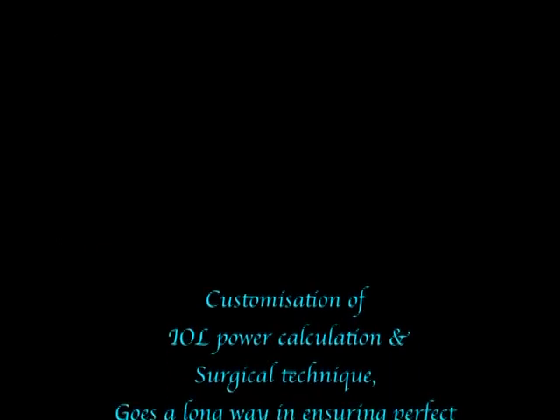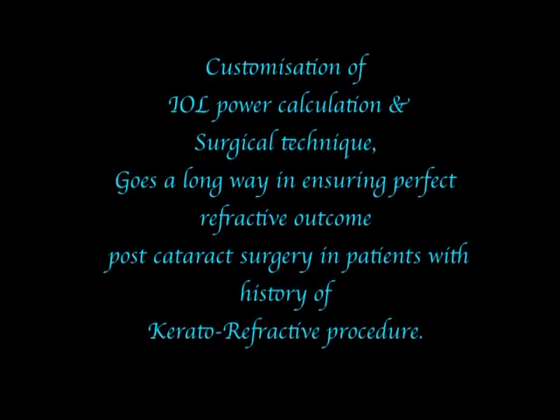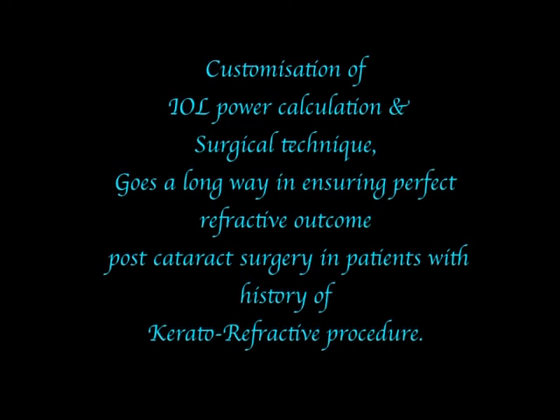To summarize, customization of IOL power calculation and surgical technique goes a long way in ensuring perfect refractive outcome post-cataract surgery in patients with history of keratorefractive procedure.